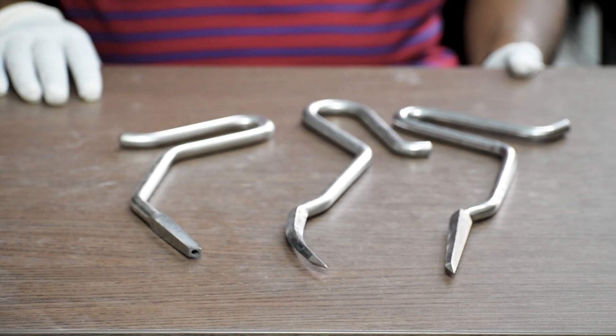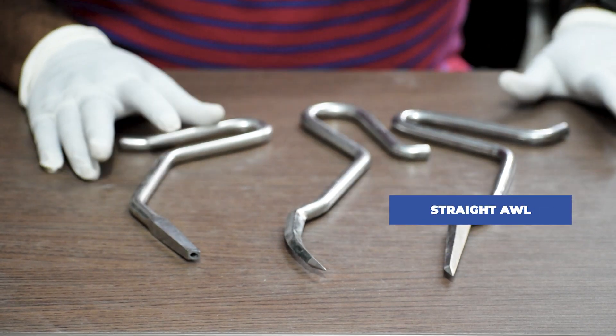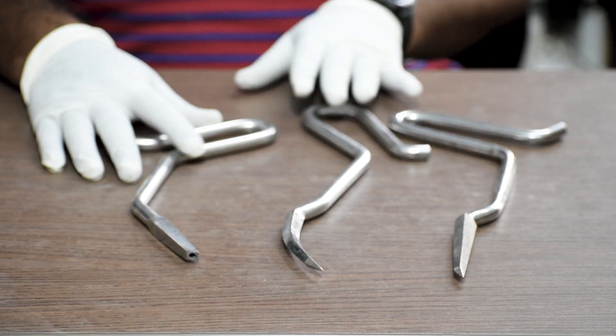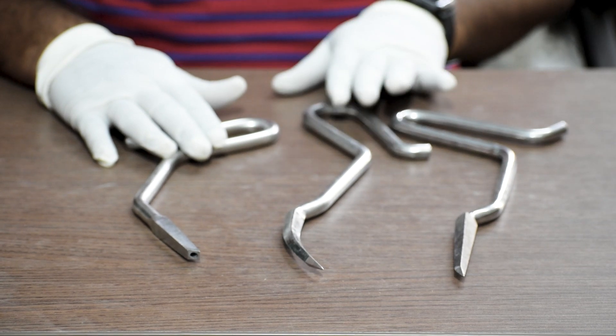We start with creating the entry point for the nail with the help of an awl — a straight awl, curved awl, or cannulated awl. It is totally upon the surgeon's choice which awl to use to create the entry point.